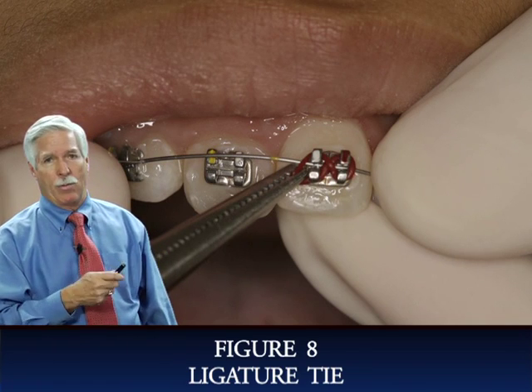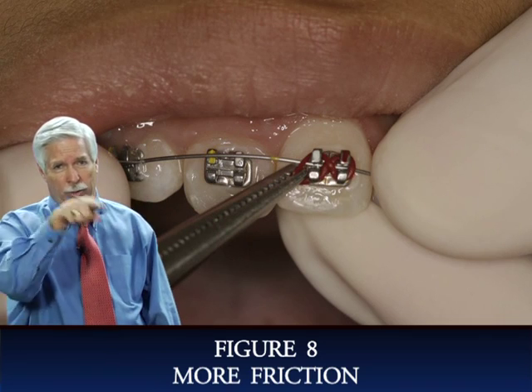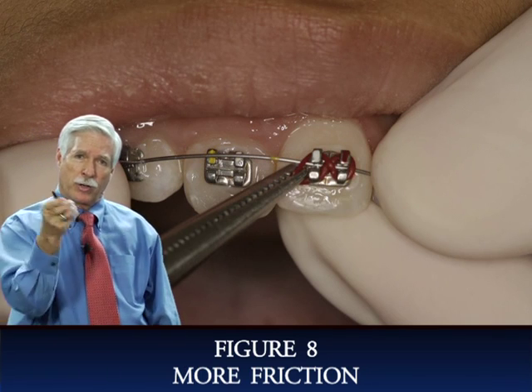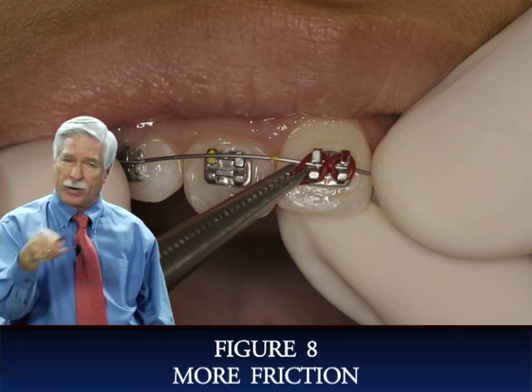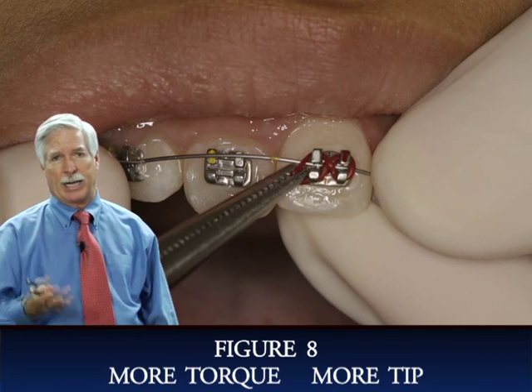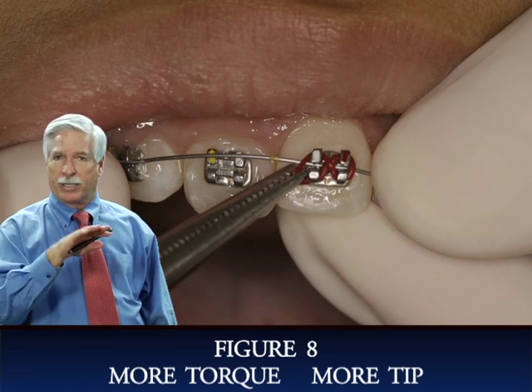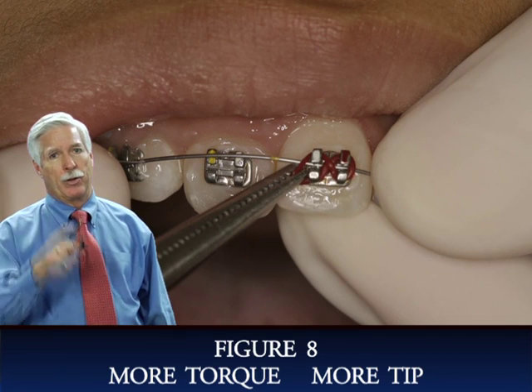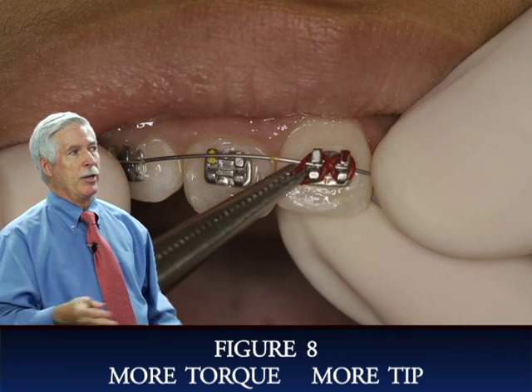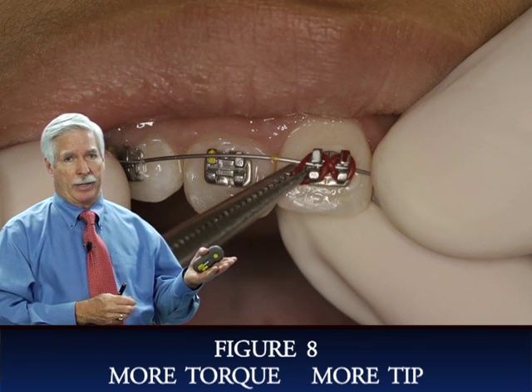So as I say, now we don't do that because there's more friction created when you do that figure 8. So now when we're doing round wires, we do it all around all 4 wings and no figure 8ing. But at the very end of treatment, if we want a little more torque and a little more tip in our rectangular wires, then we'll do the figure 8ing once the teeth have been moved into the proper position. But when you put any figure 8 on there, you are definitely slowing down the movement of the case. But you're going to see that even with that figure 8, this case moved very quickly.